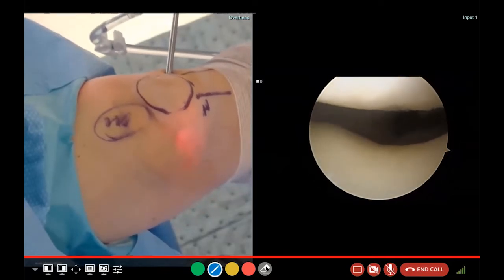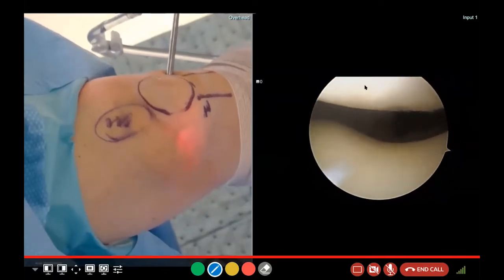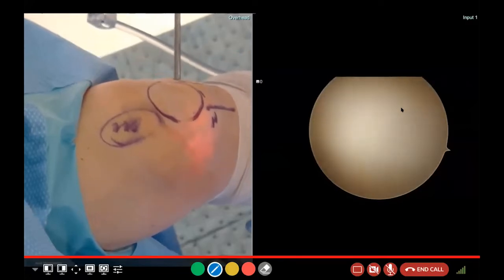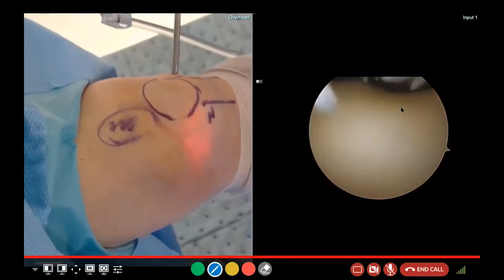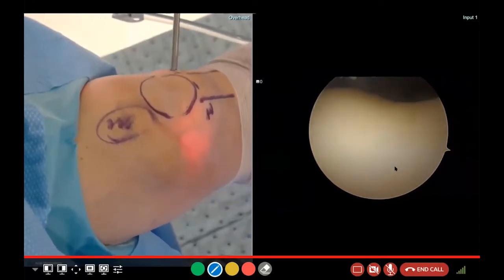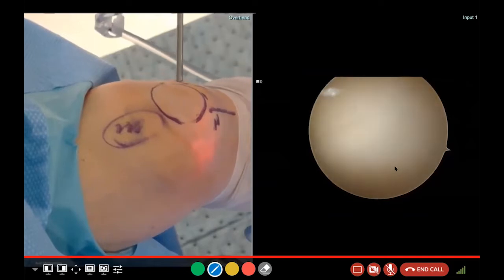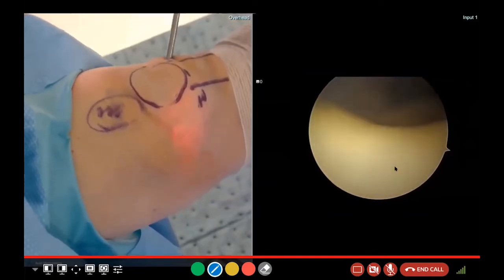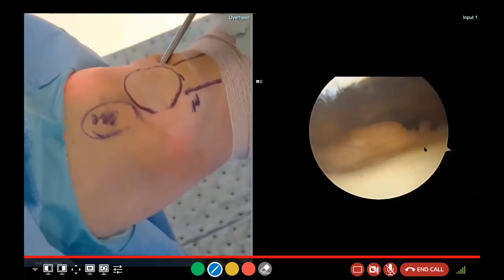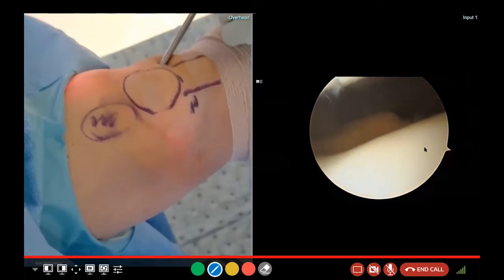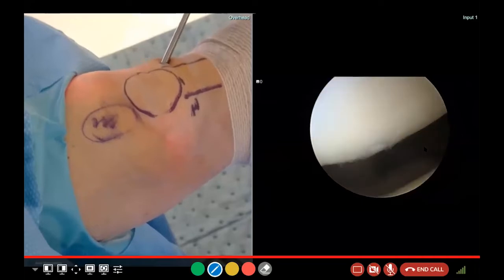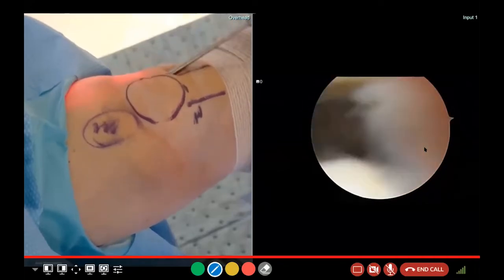That's his kneecap above us. You can see on the screen the top of what we call his trochlea — that's the femur behind. His trochlea looks pretty good; that cartilage is pretty normal. Outerbridge is a classification: Outerbridge one cartilage damage is just some softening — and he does have some softening there. You'll notice I'm using saline, which is clear, but you'll notice that yellow fluid — normal knee fluid is yellow — that's why you see that yellow wave from time to time.